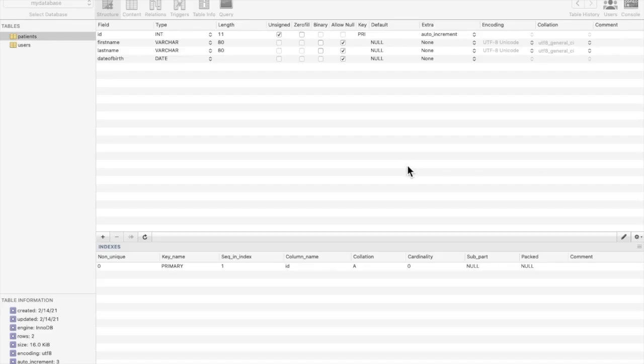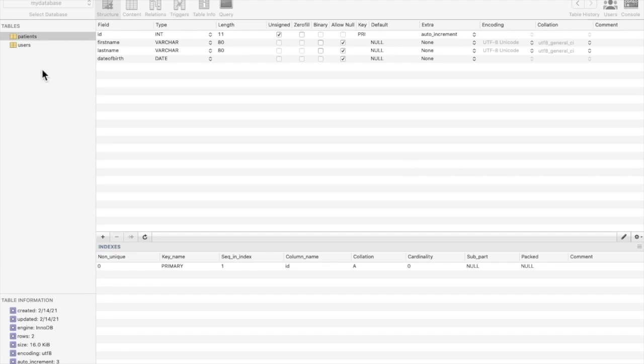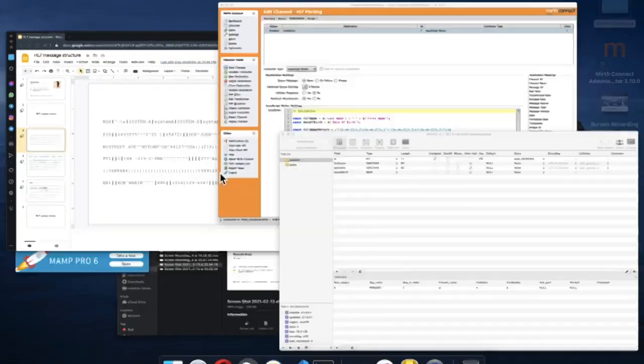In the previous videos, we saw how to parse and validate an HL7 message using Mirth Connect. In today's video, we will see how to insert data received in this HL7 message into a MySQL database. Our database contains two tables, one of them named Patient, with columns for first name, last name, and date of birth. Let's go back to the Mirth Connect console.